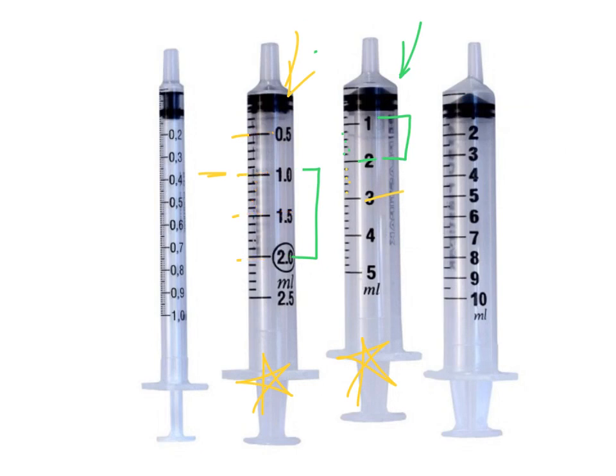So in the case where our longer increments are counted off for us in halves, in this case we're actually going to count off in tenths, a little bit different than we did on the third one on your screen there. So starting at the 1, the first one right after is going to be 1.1, 1.2, 1.3, 1.4. That's why this is 1.5. And then we can just continue to count forward. 1.6, 1.7, 1.8, 1.9. Therefore, this is 2. And we'll count the same way after the 2. 2.1, 2.2, 2.3, 2.4, and there's 2.5 already counted off for us there.